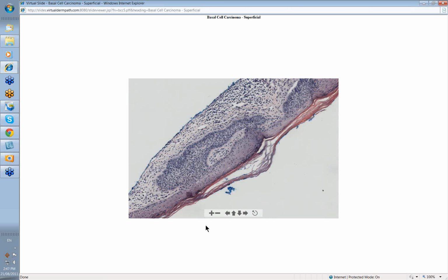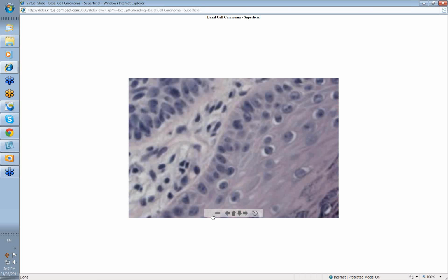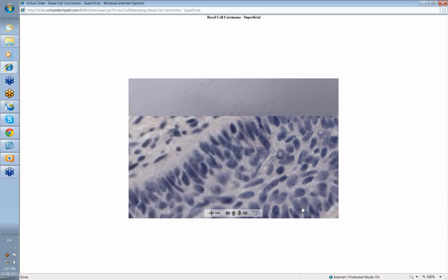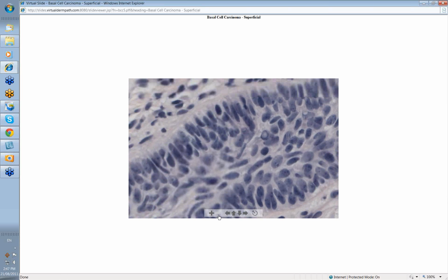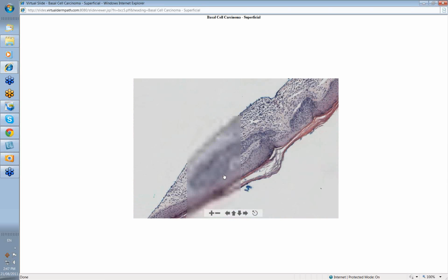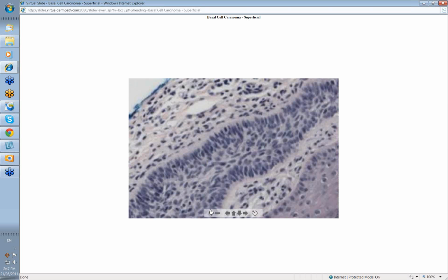If you look at these under high power, let's just go down a little bit. Bear with me till that gets into view. Actually, we could do with just a little bit less than that, in fact. It's either going to be all or none. But sometimes you can, in fact, see mitoses in these. That's better. Let's get it at that level once it comes into focus.